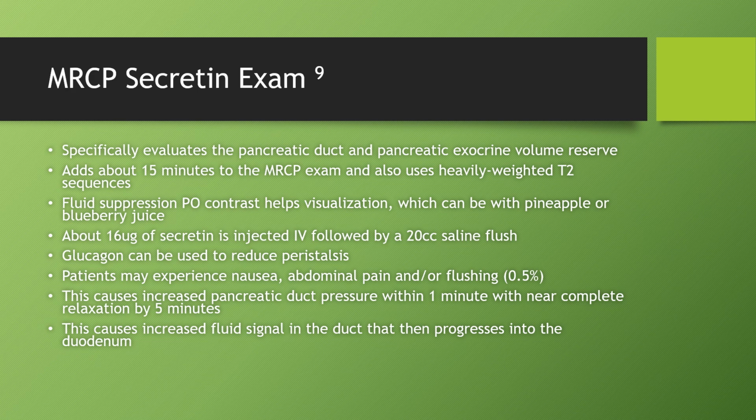So I want to talk for a minute about MRCP secretin exams. Not a lot of places are doing this. I have a little bit of experience with this. So I wanted to sort of touch on this in case you're looking at some of these articles and guidelines and you're thinking, what in the world is she talking about?